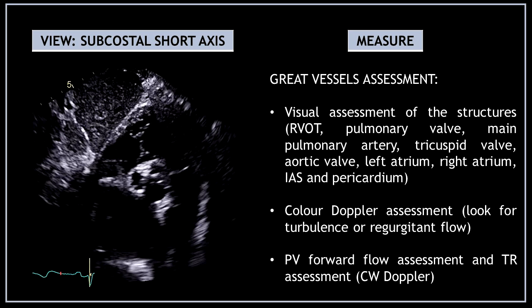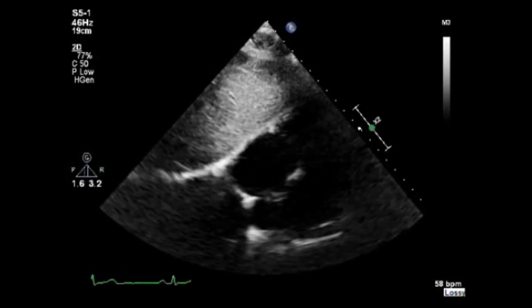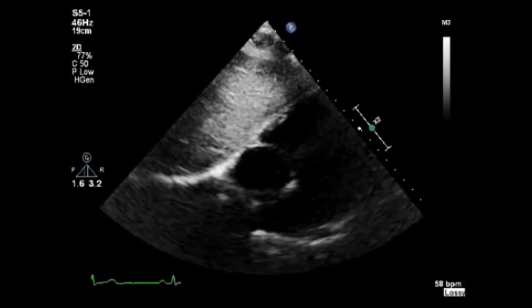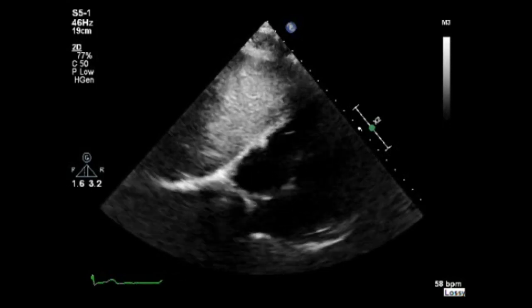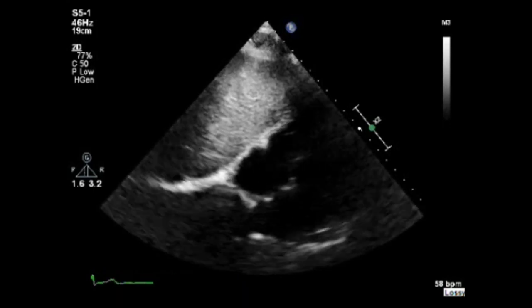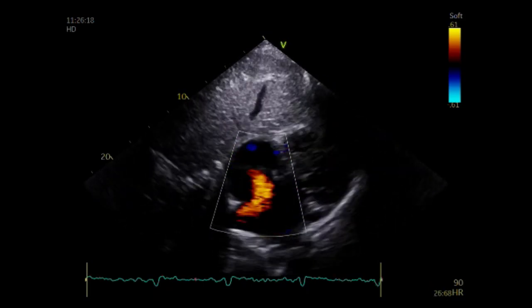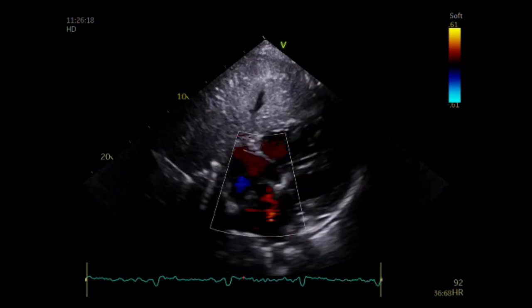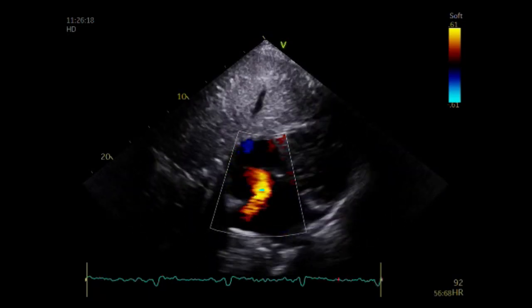Start performing these views more often and you will be amazed at how many people have really good images from the subcostal view. Now I'm going to show you on video one by one all the minimum data set you need to obtain in the subcostal view. First obtain the subcostal view and start with the visual assessment of the cardiac chambers, then assess the valve anatomy, check for the integrity of the inter-atrial septum, and have a look at the pericardium. Use color Doppler to check for shunts and remember to reduce the Nyquist limit to detect low velocity flows.